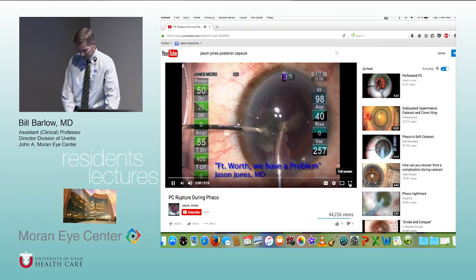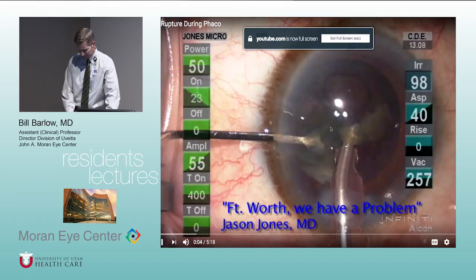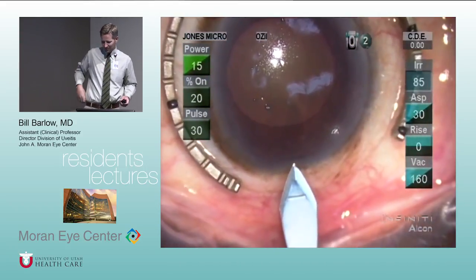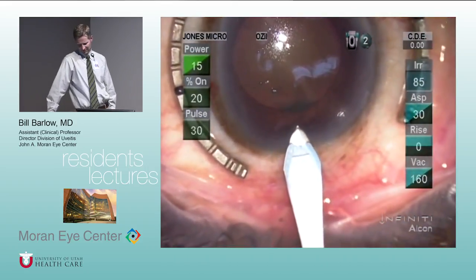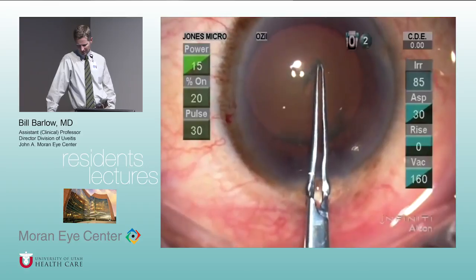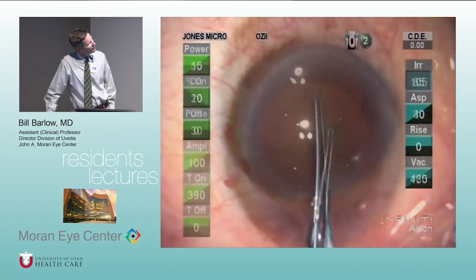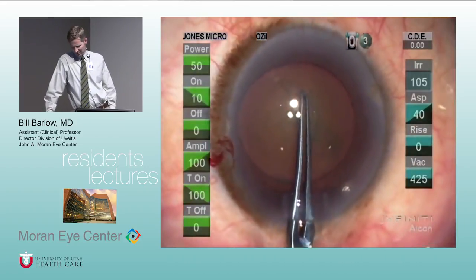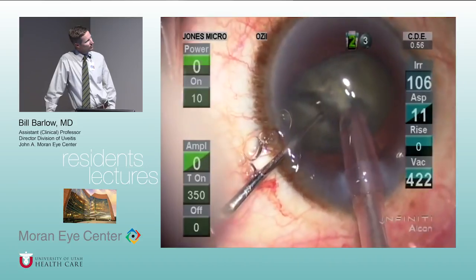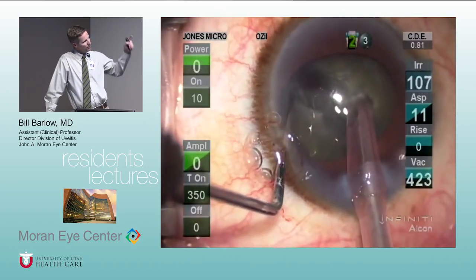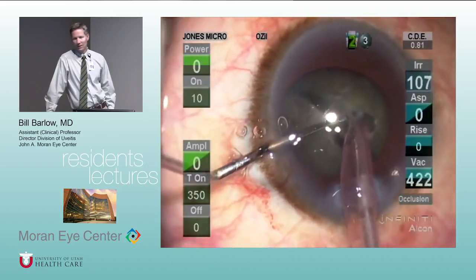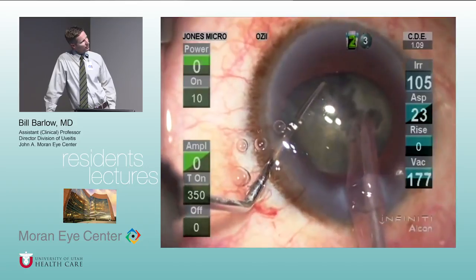Jason Jones is a former Moran resident and now a high-volume surgeon in Iowa. In this video, you can see he's creating his wound very deliberately, completed his capsulorhexis, and is using a sharp chopper — a modified vertical chop technique. He buries the tip, goes peripheral, drives it posteriorly toward the phaco tip. Then we can see a break occurring posteriorly — the posterior capsule has come forward.